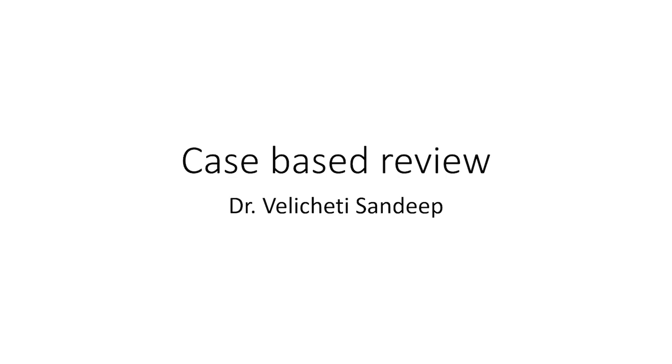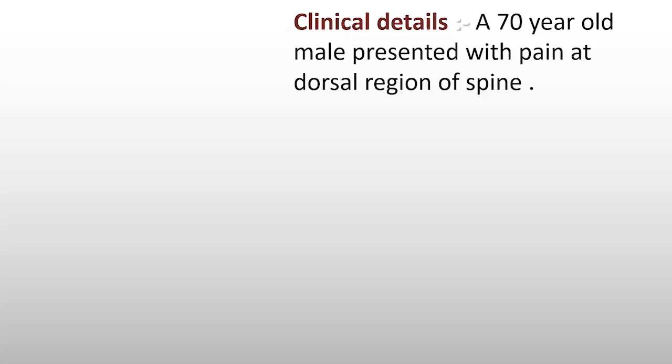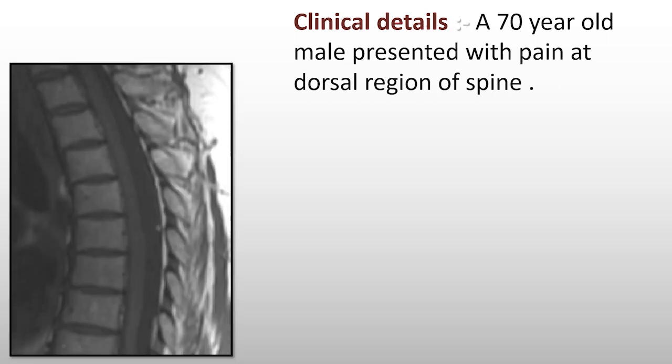Good morning everyone, welcome to another case-based review. Today is a historical case. This is a 70-year-old male patient presenting with dorsal pain, which is the reason an MRI has been performed. There are no neurological deficits or symptoms, mainly dorsal pain. On T1-weighted MRI images, we can see a small rounded sub-centimetric T1 hyperintensity along or just anterior to the dura in the subarachnoid space, without significant abnormality in the rest of the spine except degenerative changes.